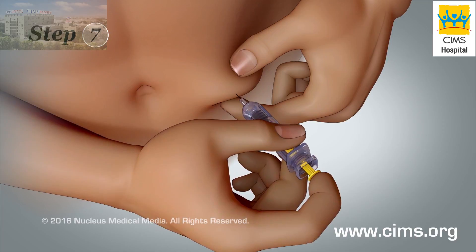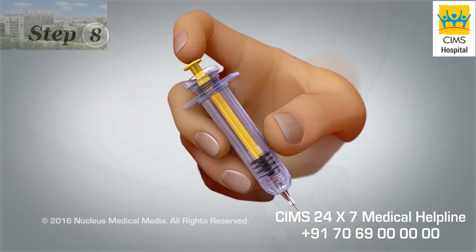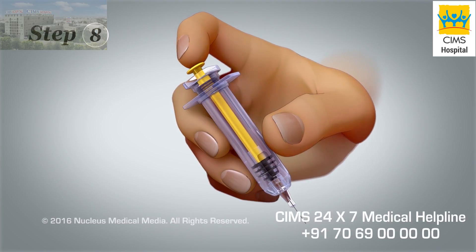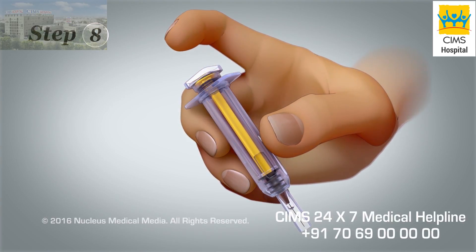Step 7. Pull the needle straight out of your skin. Step 8. Press down firmly on the plunger to activate the safety guard, which covers the needle.